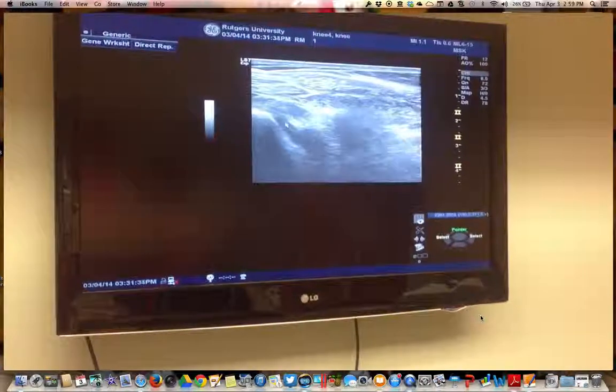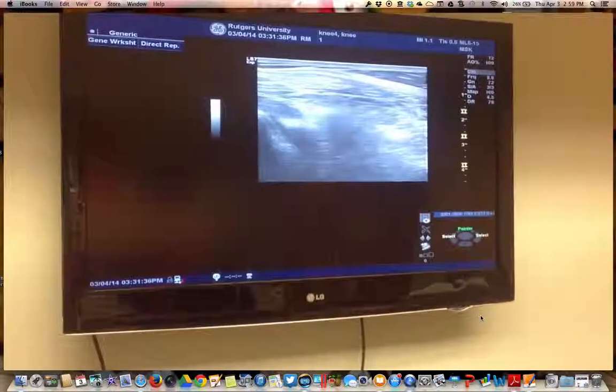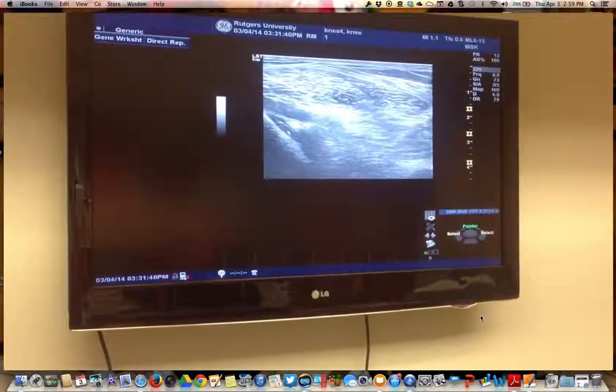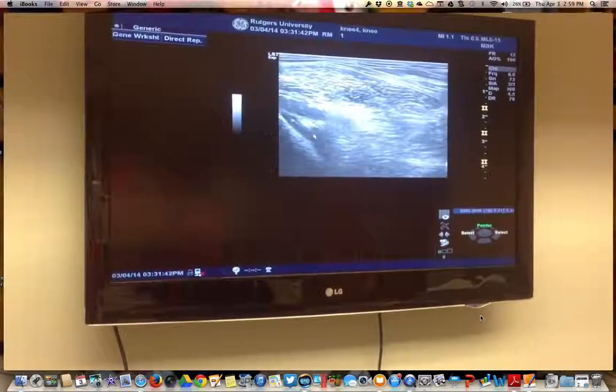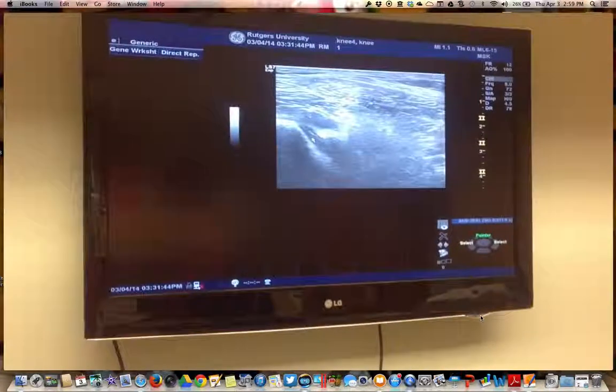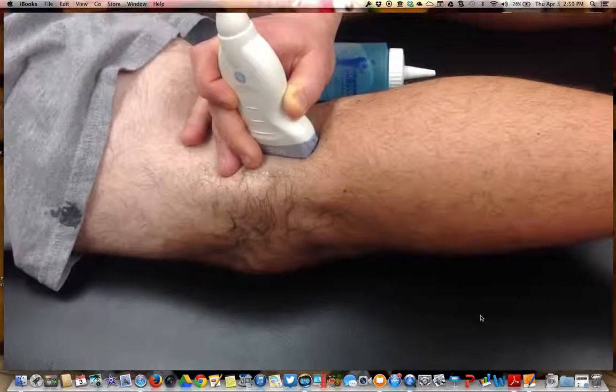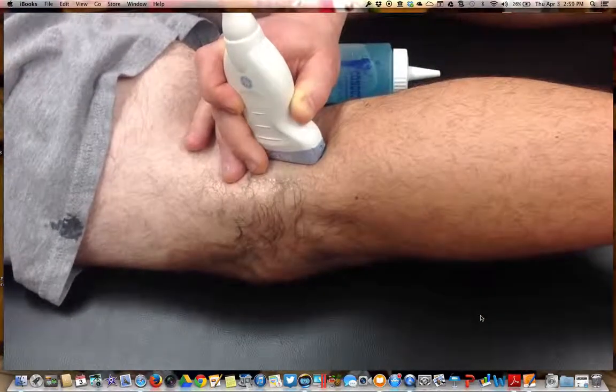This is the insertion of the posterior cruciate ligament. We only see its distal insertion because it comes through and we lose it as it goes in the joint. Do note that there's a slight medial pivot to my probe here, going towards the medial aspect to better line up with the PCL.